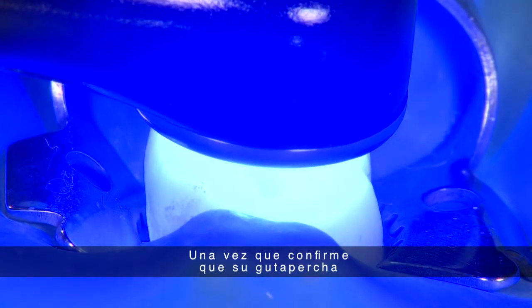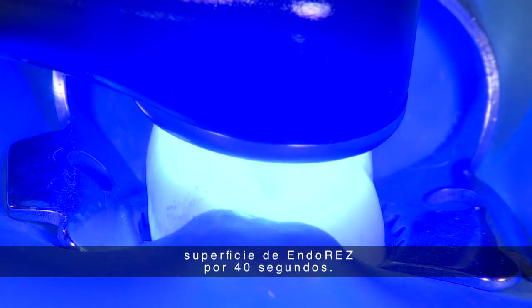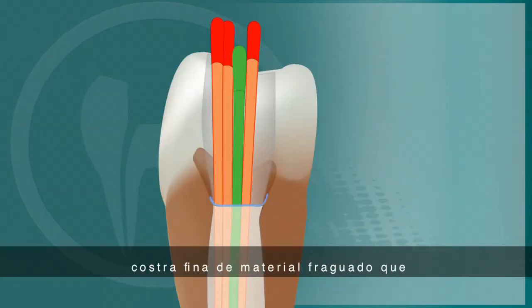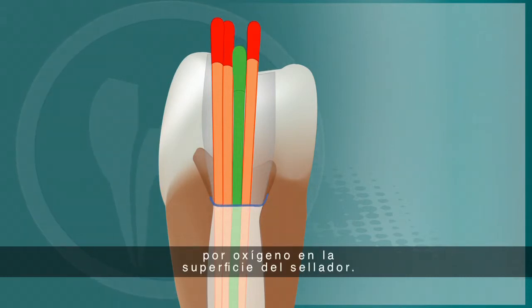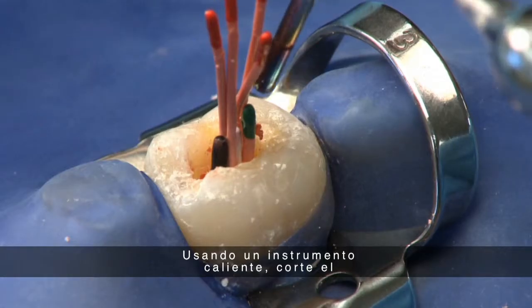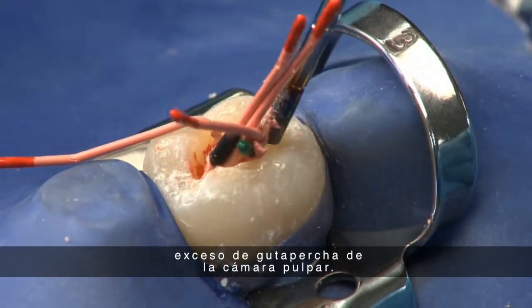Once you have confirmation that your gutta percha is properly placed, light cure the surface of the EndoREZ for 40 seconds. This will not fully polymerize the EndoREZ in the canal, but create a thin crust of set material that will act to prevent an oxygen-inhibited layer from being present on the surface of the sealer. EndoREZ should be completely polymerized in 30 minutes. Using a heated instrument or searing device, trim the excess gutta percha from the pulp chamber.